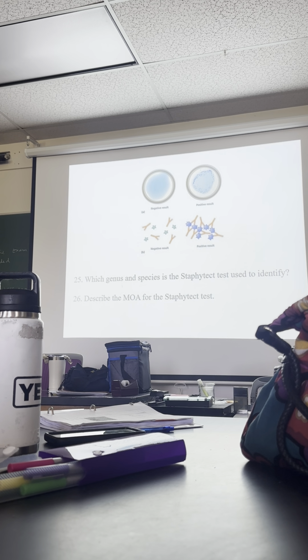Only the Staphylococcus. It shouldn't react with anything else. Although in our test, there was some clumping with things that weren't supposed to clump. So the salesperson came to visit Myra, and what they found was the test was bad. So he gave Myra a new set and a little gift, so she was happy. But this is very specific only for Staph aureus.